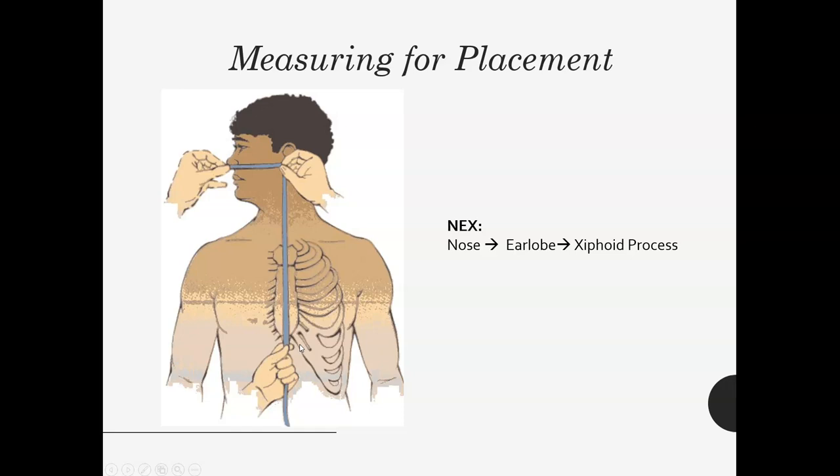So once you've measured it, you need to mark it. You can either do this with tape or a Sharpie. Sometimes they have markings on them, and if you remember what number it's at and you document that, that's okay too.